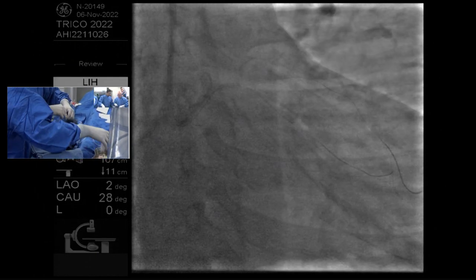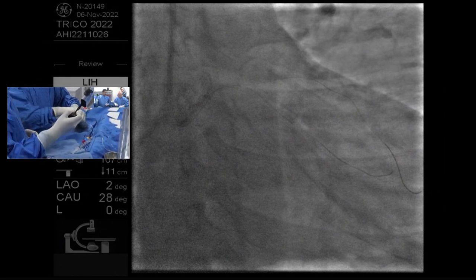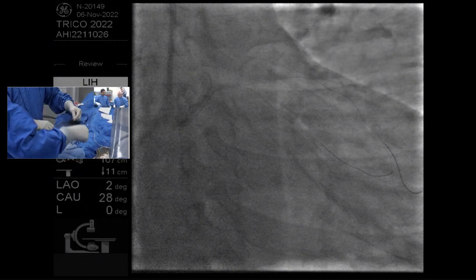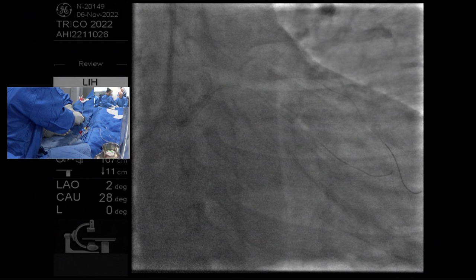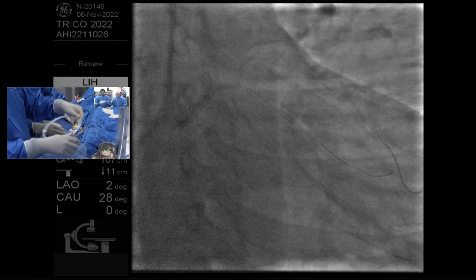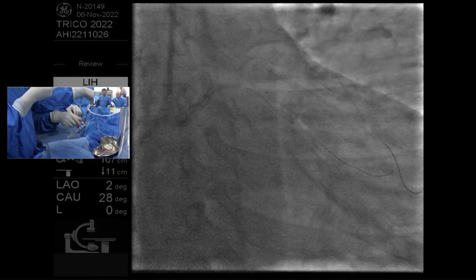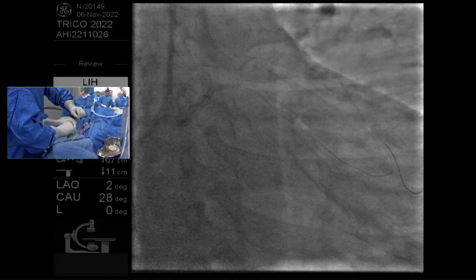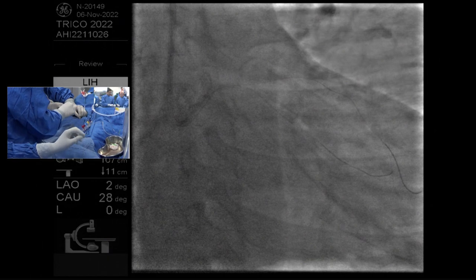But going after that, Rob Riley, myself, and a few others wrote a paper a couple of years ago called The Algorithms Within the Algorithm, where we discussed these types of problems. Algorithms set up to solve wire across, gear won't go, and these types of problems that you encounter in CTO PCI. I think the way we divided it up was three fundamental areas. One is ways to increase support. Second is ways to modify the lesion. Third is ways to obliterate the lesion.